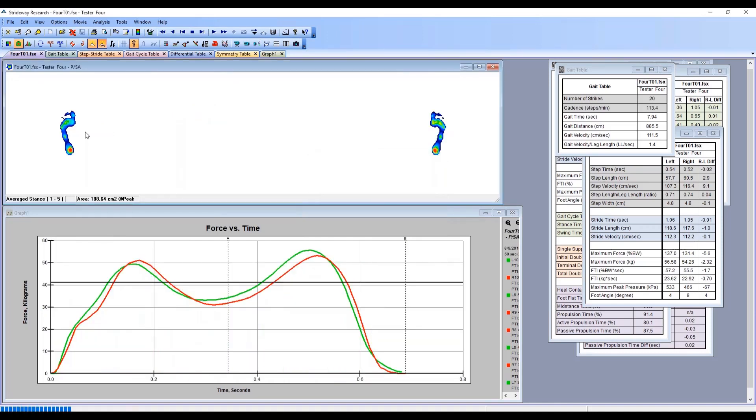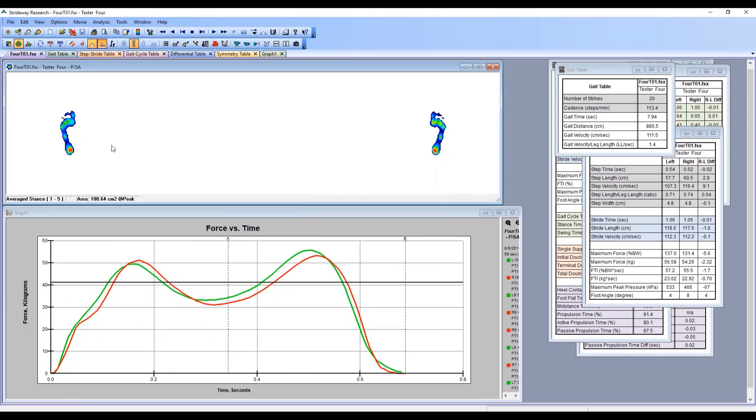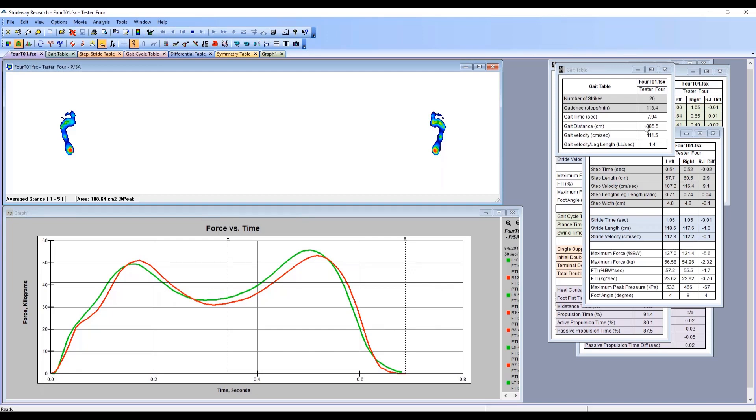We'll say okay. Now you'll see one pressure profile for the left, one pressure profile for the right, and one force curve for the left and one force curve for the right. This would be the average of all the total 20 foot strikes that we had there.